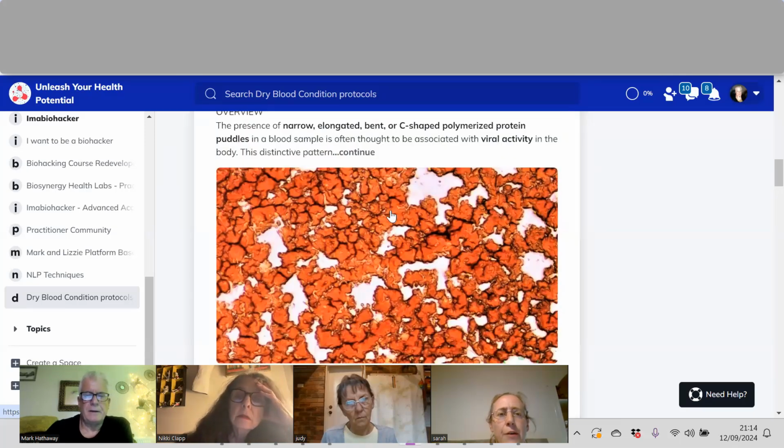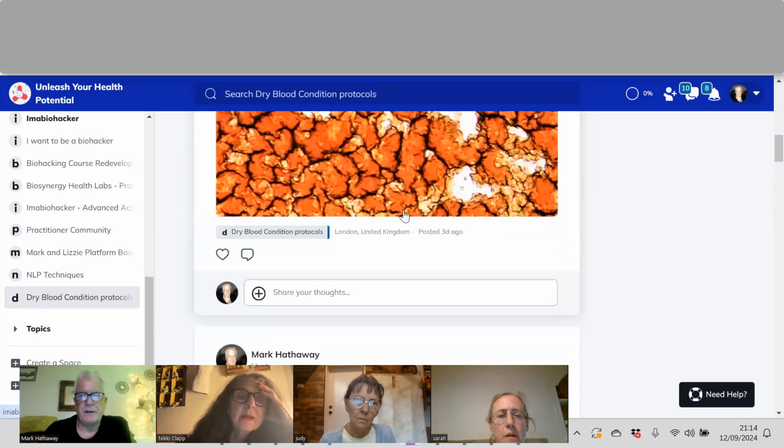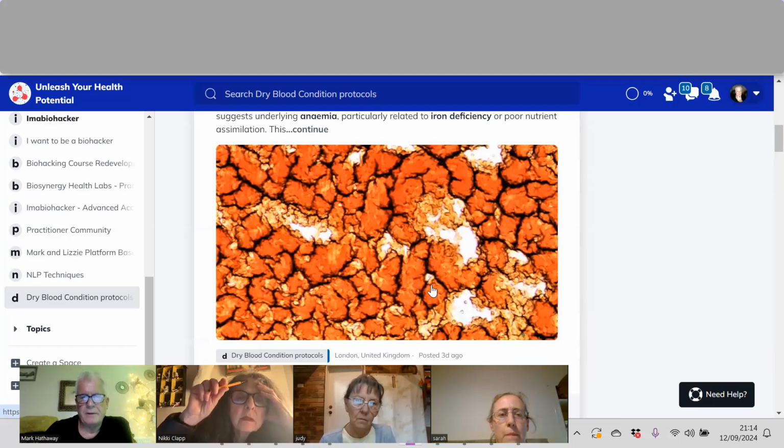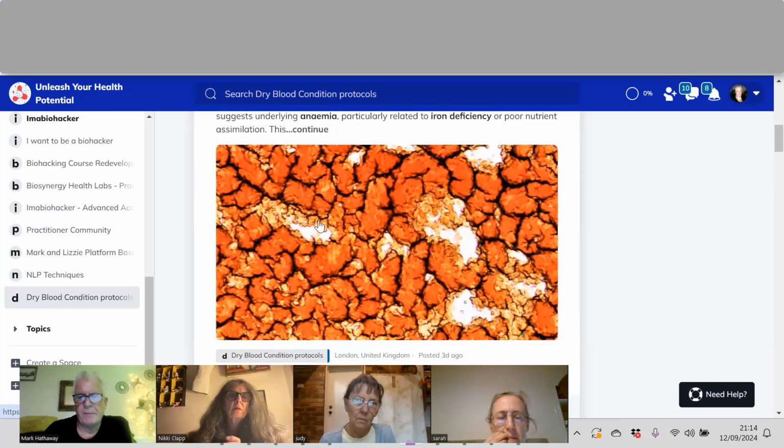Is that the liver? No, this is the liver up here. We'll get to the liver in a minute. But they're all different. Where's that from? This is just a different sample.